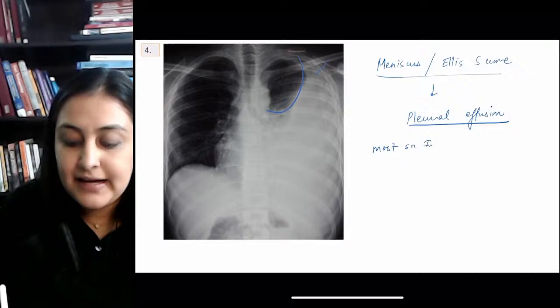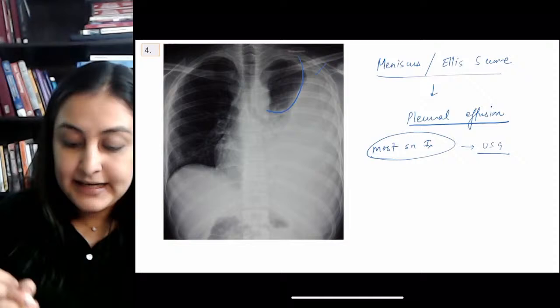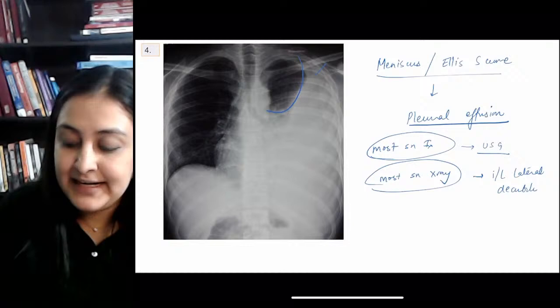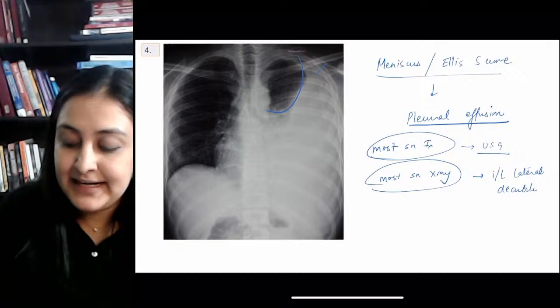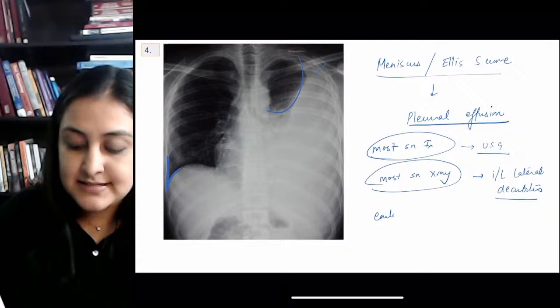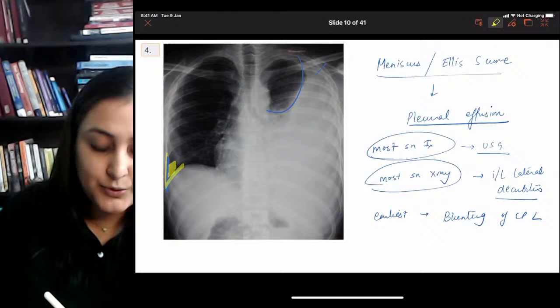The most sensitive X-ray to detect minimal pleural effusion: place the patient on the involved side — ipsilateral lateral decubitus — so the fluid becomes dependent. On a frontal PA X-ray, the earliest sign of pleural effusion is blunting of the costophrenic angle. The CP angle — costophrenic angle — starts to get blunted because dependent fluid accumulates there due to gravity.